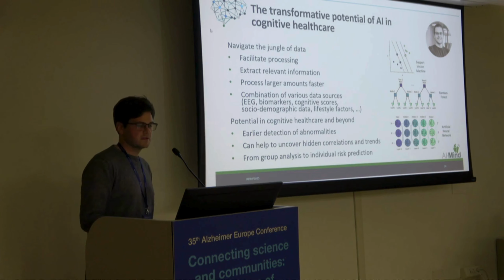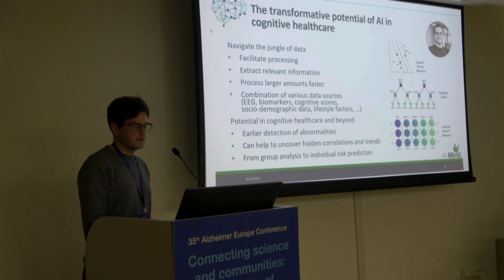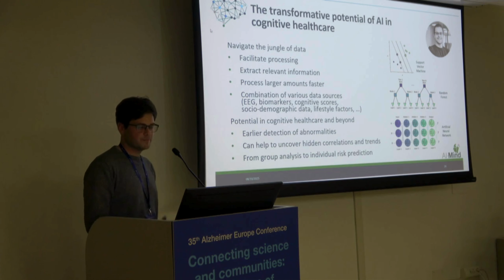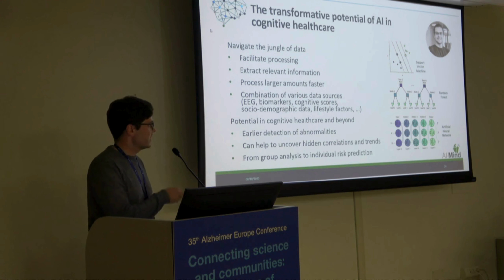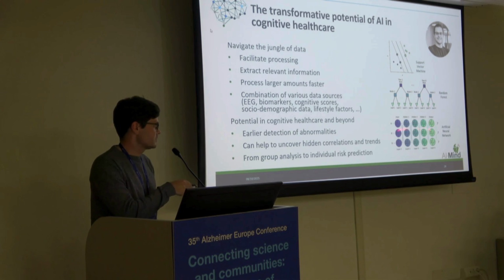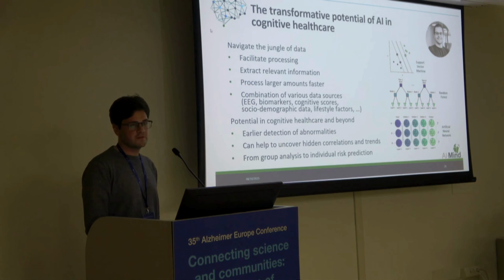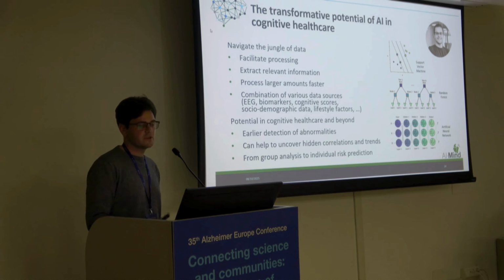Furthermore, I talked about the processing, like the cleaning of the data. This is an automated process already, but there are still manual interventions needed, and AI could also help to facilitate this even more. Then I showed you how we extract the power spectral densities and the connectivity measures. There are AI methods, for example the artificial neural network that I'm showing at the bottom here, that can automatically extract relevant information from the data themselves, so that this step would be automated as well.